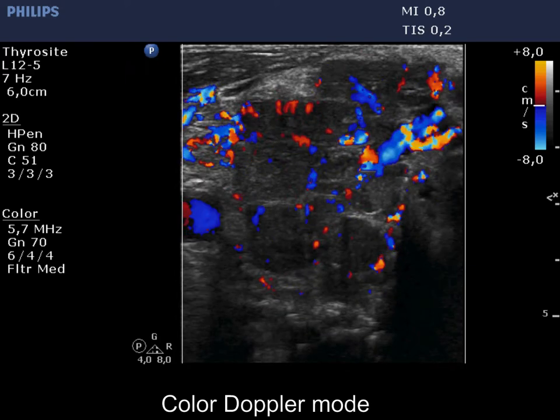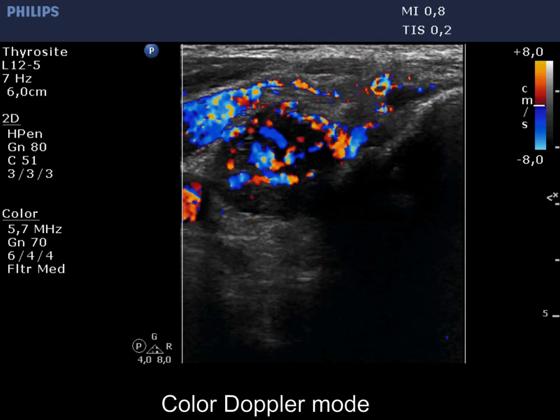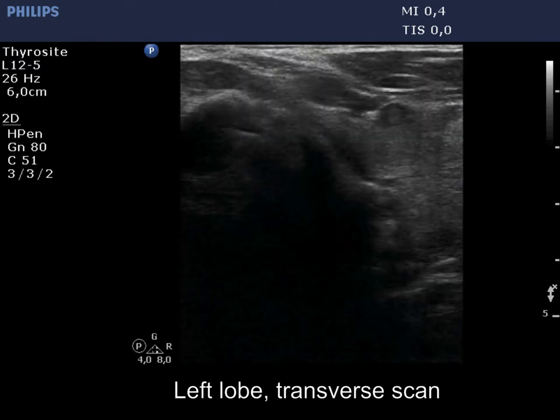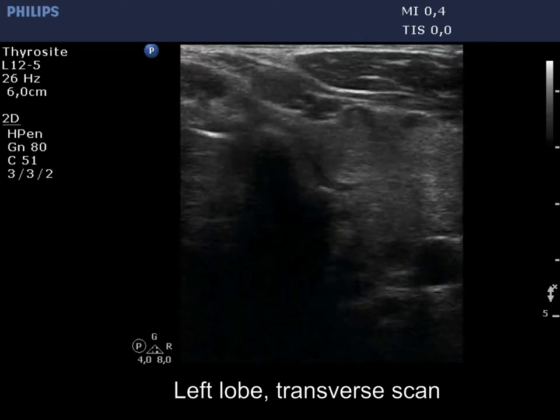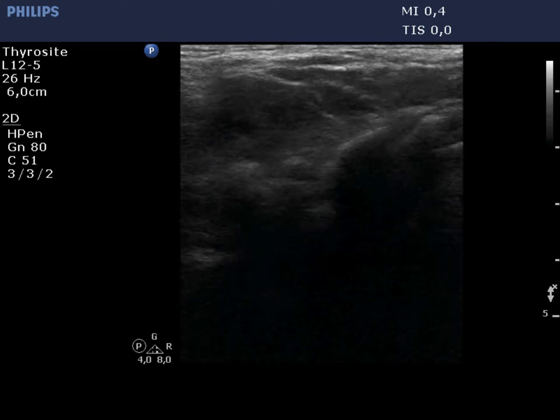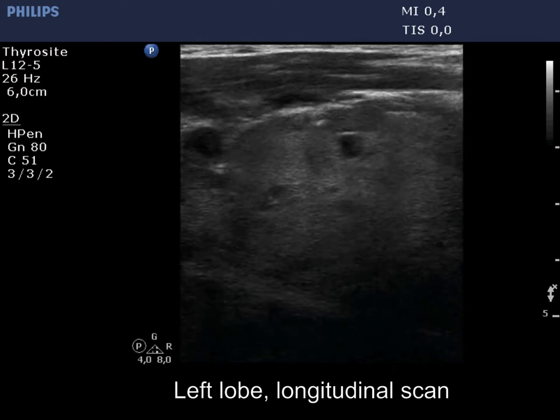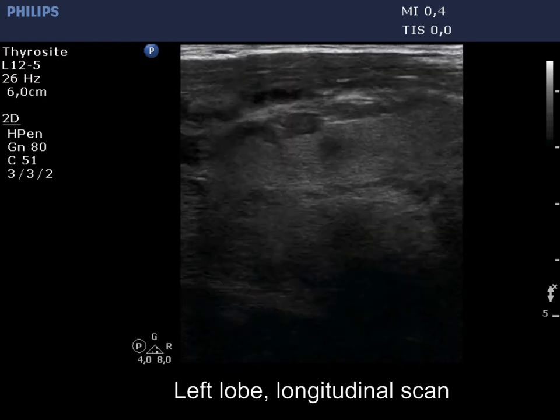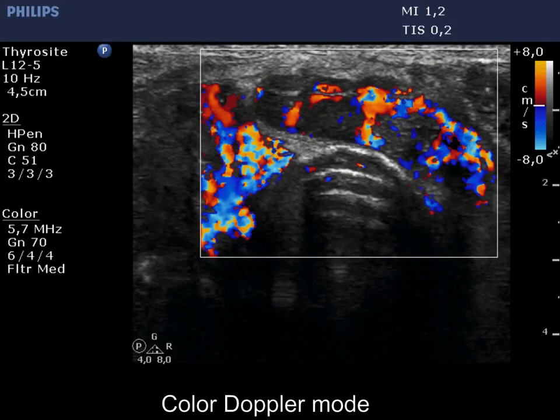The vascularity is irregularly increased. Besides cystic lesions, tumorous tissue can be found in the left lobe and in the isthmus. The moderately hypoechoic lesions are malignant. The vascularity is also irregular.